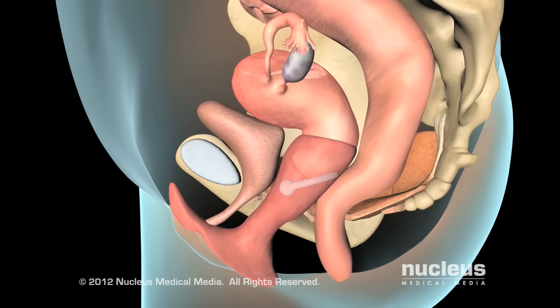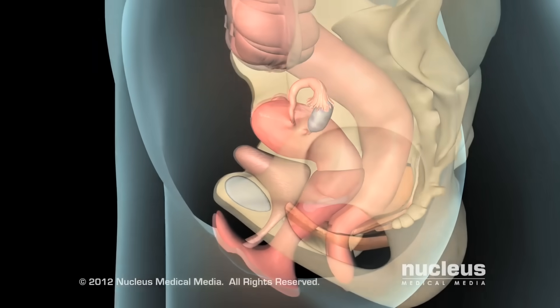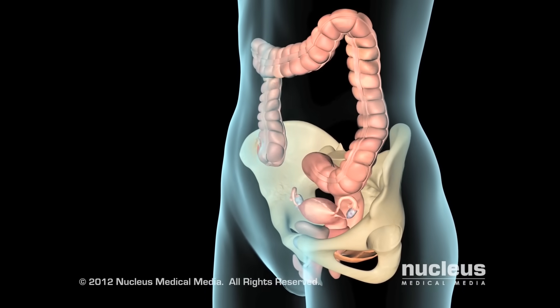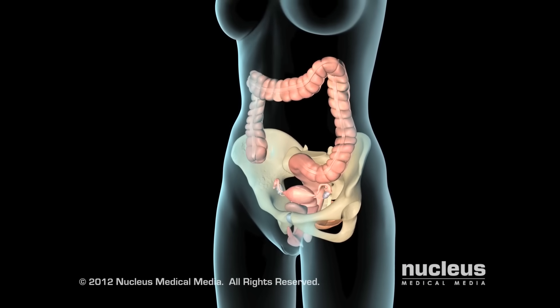You should not feel it once it is in the correct position. You may need to try several sizes and styles to ensure proper fit. Because even the best-fitting pessary may cause irritation, your doctor will want to check you every three to six months.